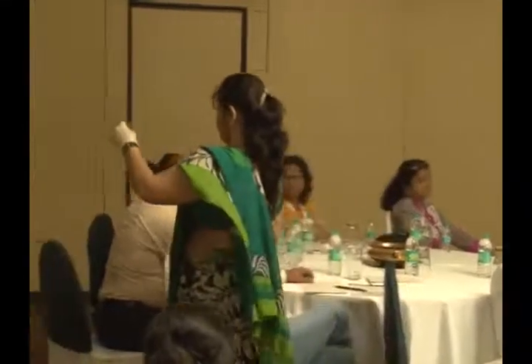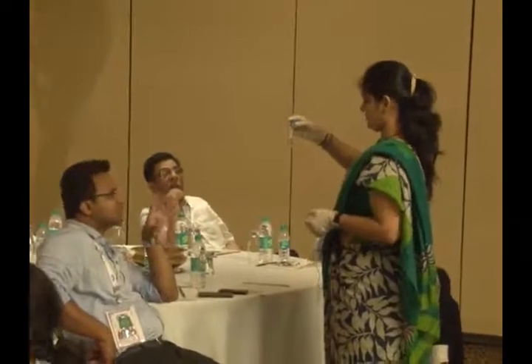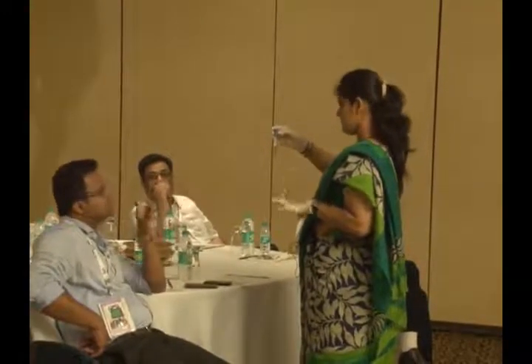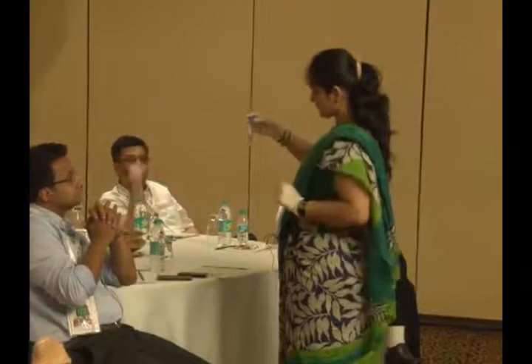If the sample is less than 1 ml, then you take 1 ml, 1 ml and 0.5 ml of the sample, whatever the sample quantity. We should be consistent with 1 ml of reagents. If it is more than 1 ml, then you have to take more media. Suppose I received a 2 ml sample, then you take 2 ml, 2 ml, 2 ml.